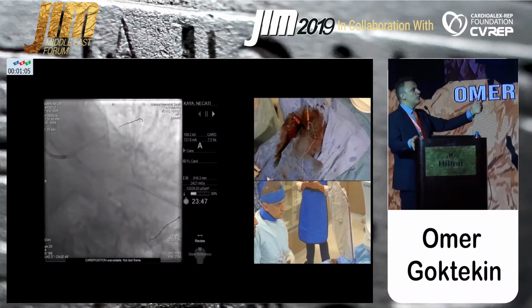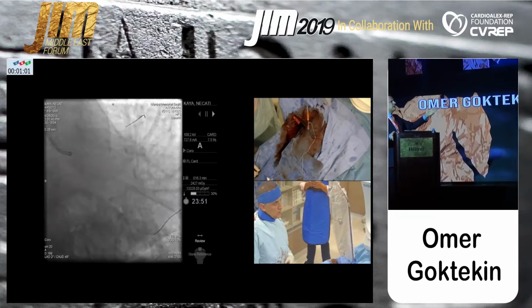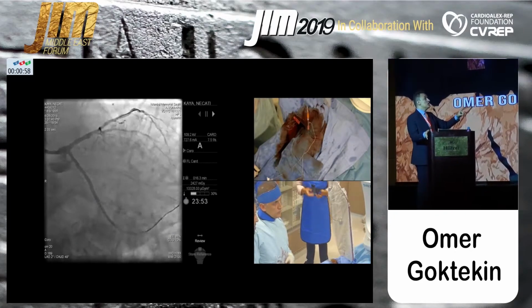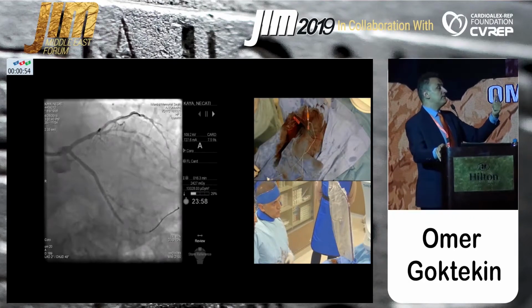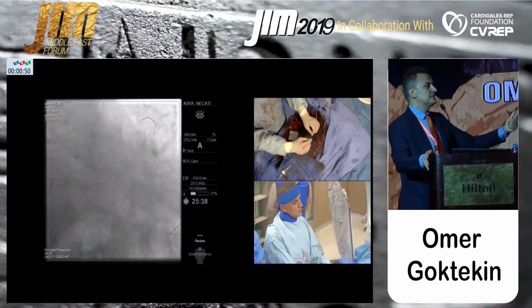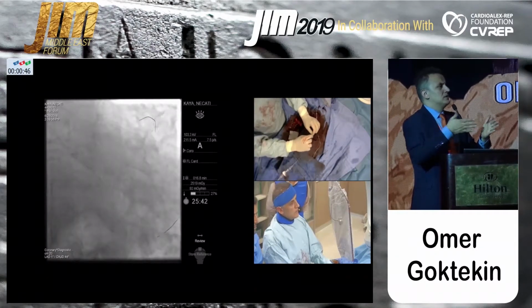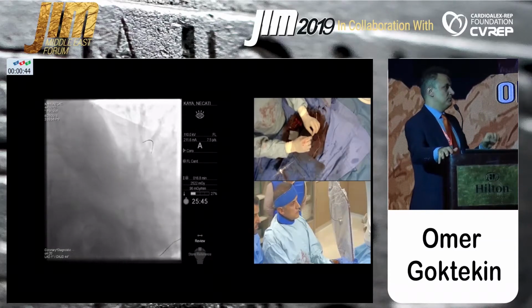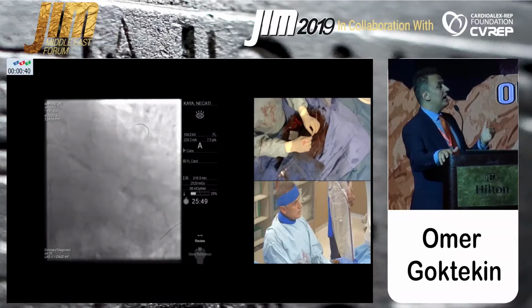So in here, I'm okay if I have the flow of that, because I don't think I can put a stent there. You mean the recross? That's the point. If I recross it, most probably I have a dissection because it was subtotal occluded. I did dilatation, so it's very high risk for me to go subintimal. So that's why I didn't do it.